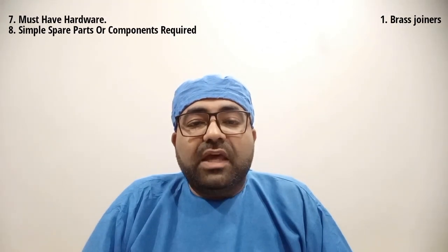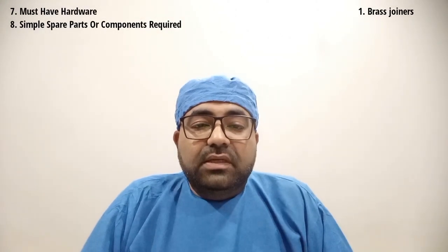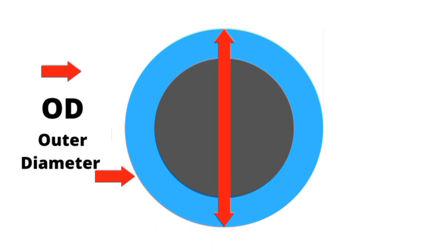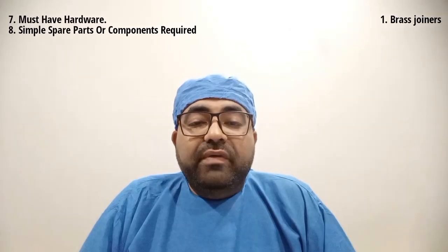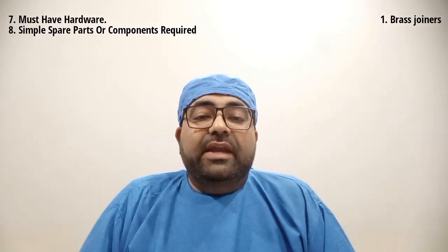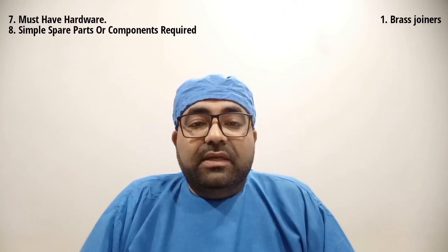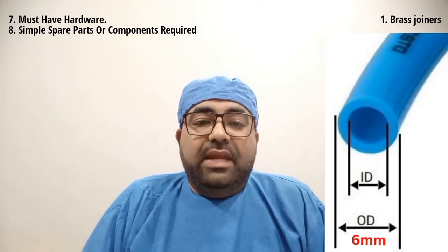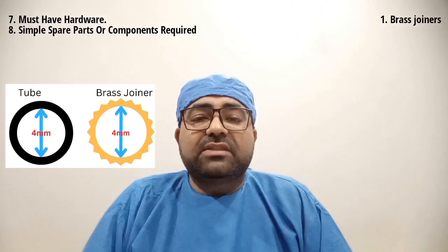The most common sizes of joiners used in dental chairs are 6 mm, 4 mm, and 2 mm. Please remember these are the inner diameter of the brass joiners. Here is a diagram as a reference to understand what is an inner diameter and what is an outer diameter. For a perfect and tight fit, the inner diameter of the tube is calculated, and a brass joiner of similar size to the inner diameter of the tube is connected inside the tube. For example, if a tube has an outer diameter of 6 mm and an inner diameter of 4 mm, the ideal brass joiner size is 4 mm.